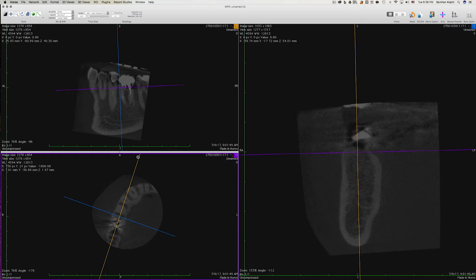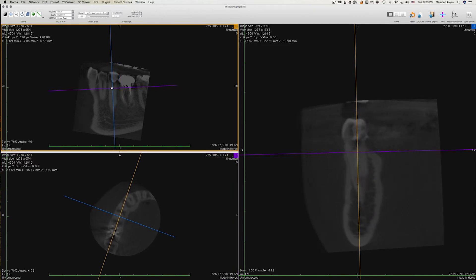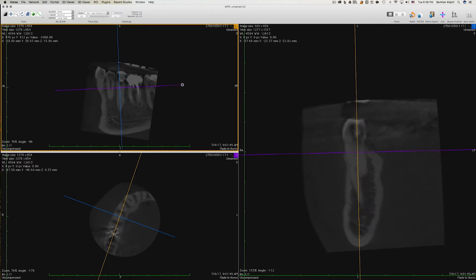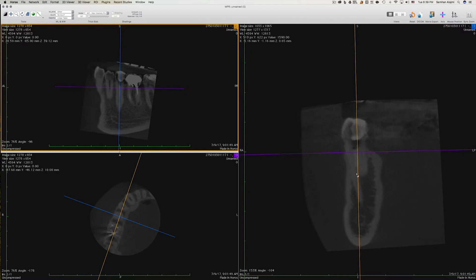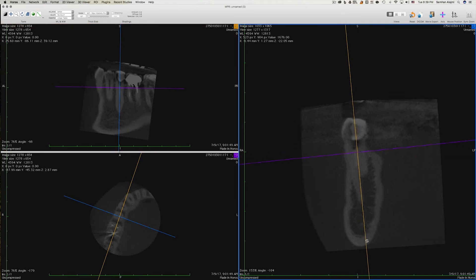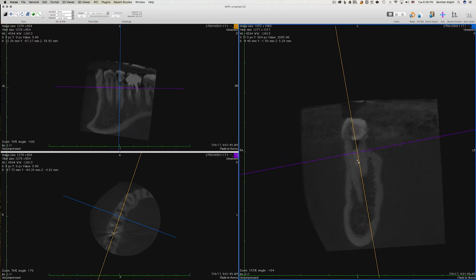I like to align these handles along with the teeth, so the sagittal is going to be parallel to the teeth. In the sagittal view I like to keep the coronal vertical with the root, and in the coronal view I like to keep the sagittal vertical with the root. This way I'll be able to examine each root separately.